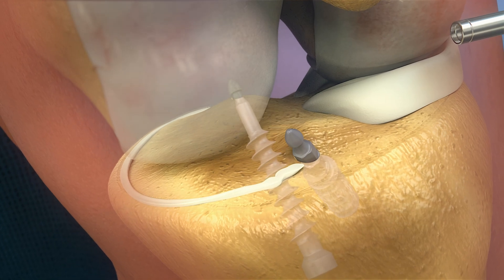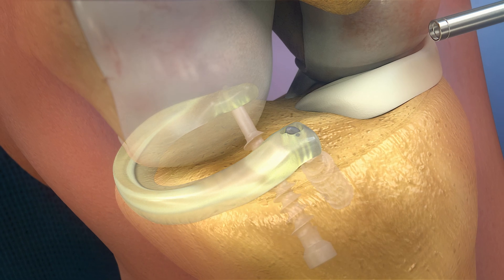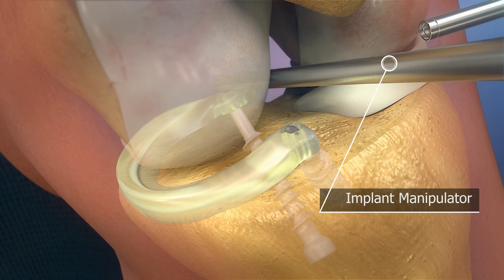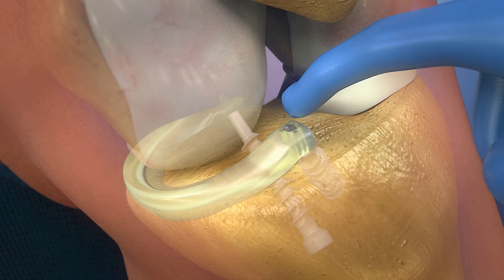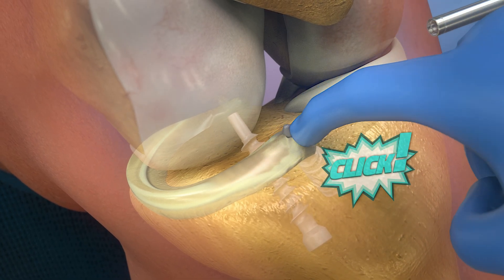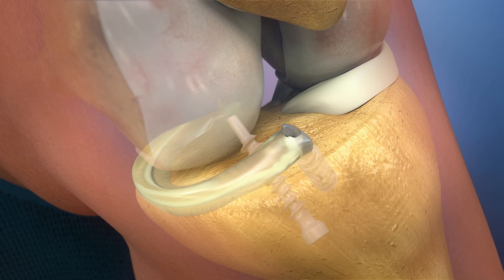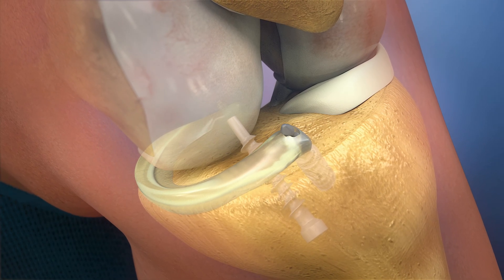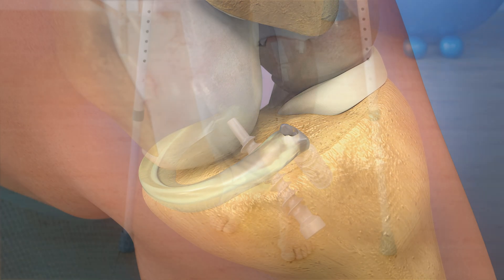Now the implant is inserted with the implant inserter and locked into place with the implant manipulator. The anterior horn can be clicked onto the screw with the finger. During the last check, the implant and its size are inspected. It is important to confirm an unaffected range of motion after the procedure.